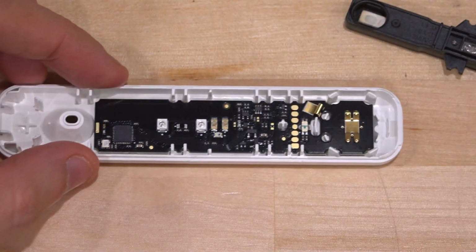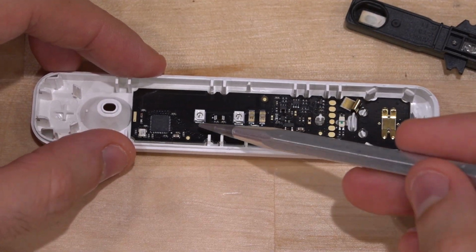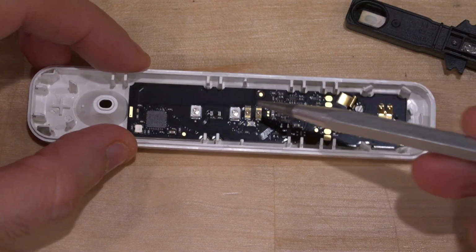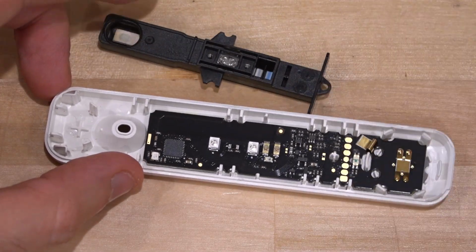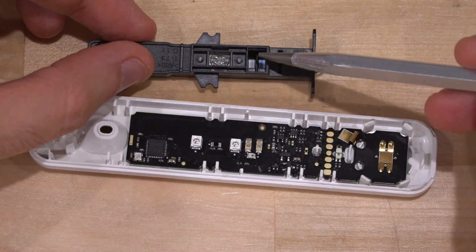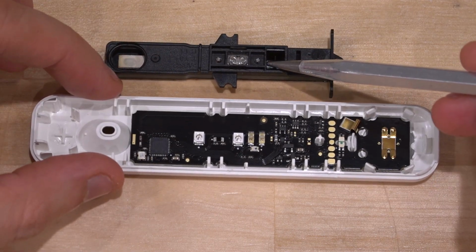And here's the electronics. So unsurprisingly, we have a whole bunch of different detectors and LEDs in here. So there's two groups of them, and it looks like they join in two sections. There we go. That makes sense. I think this is for the reference to ensure that the test is being done correctly.